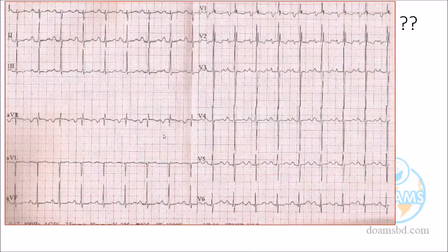If you don't talk, you will learn less. It is very true. This is a live ECG recorded, from our collection also. Have a look, everyone. There is also enlargement of an atrium here. Don't be busy with other findings, because we are learning the ECG piecemeal. Just identify which atrium is enlarged here. Please raise your hand spontaneously.